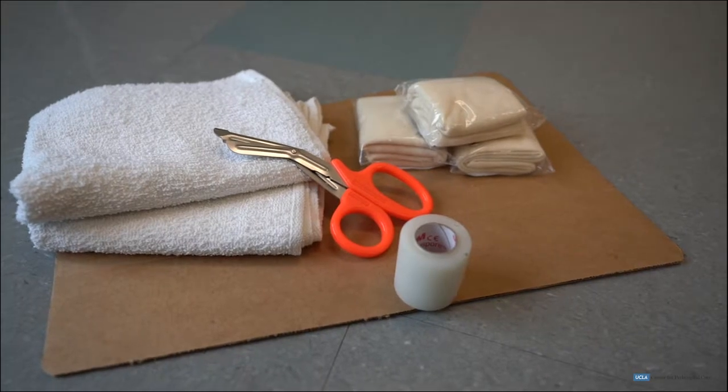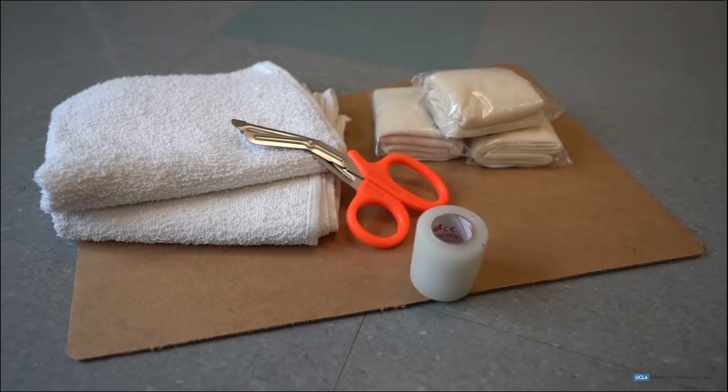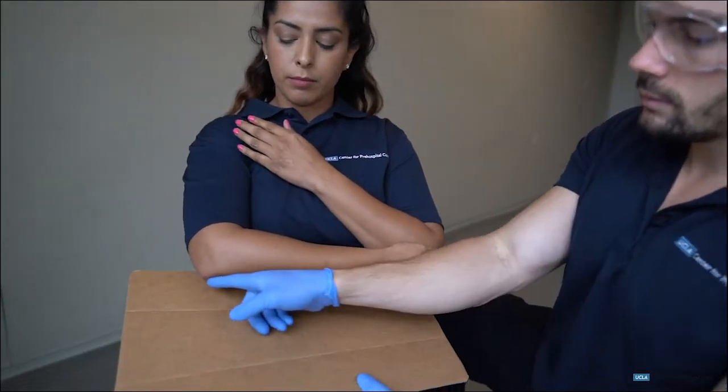The EMT will then select the proper splinting materials to immobilize the injured joint. We will be using a rigid splint and triangular bandages. The EMT will then measure the splint on the uninjured extremity.